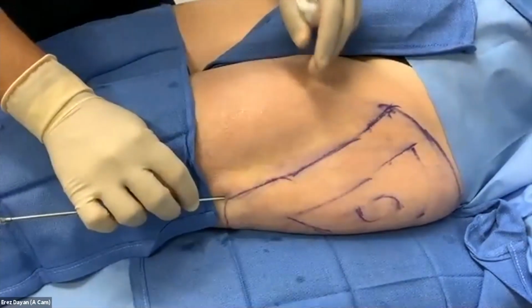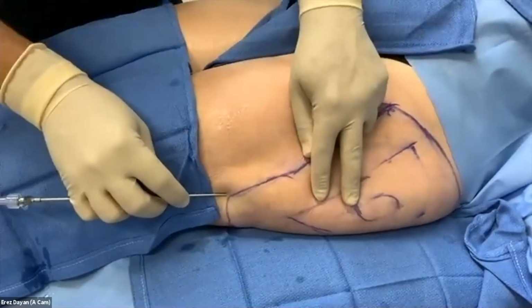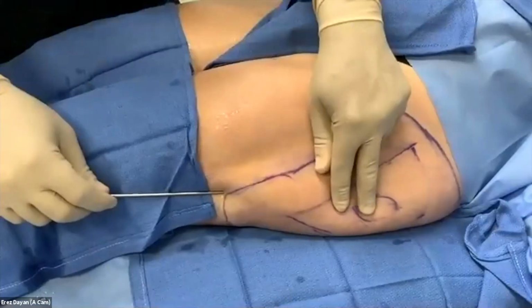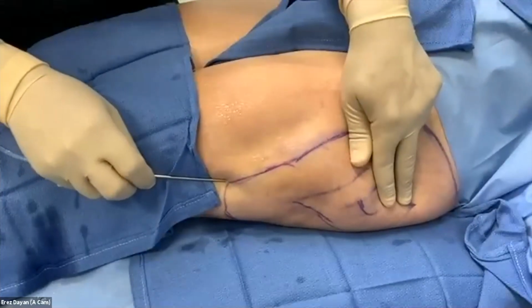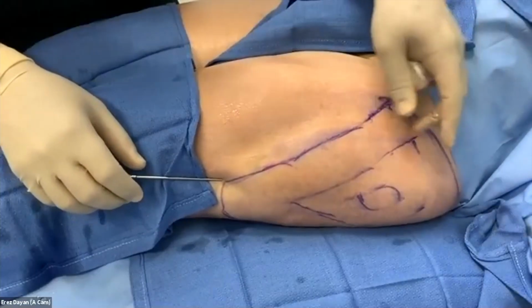Okay. So I'm just going to slowly infiltrate here. My cannula is always behind the area where I'm filling. And I like to get a good amount of tumescent in here because I don't want her to feel any pain. You doing all right there?